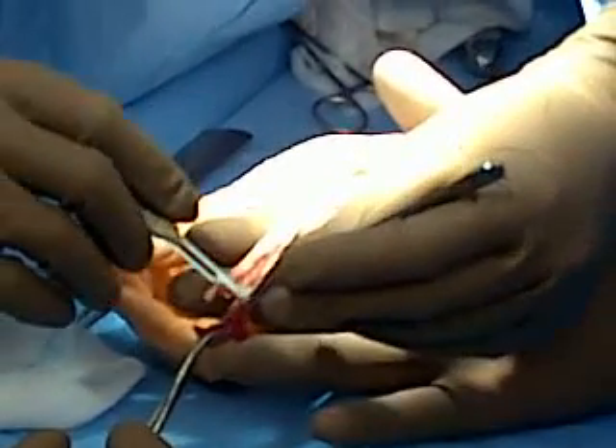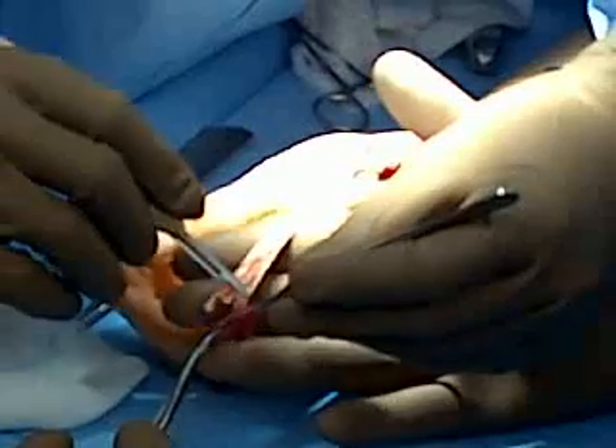I try to get so much of it off as I can without damaging the piece of tendon that I want to use.